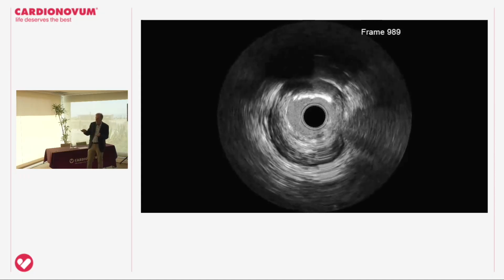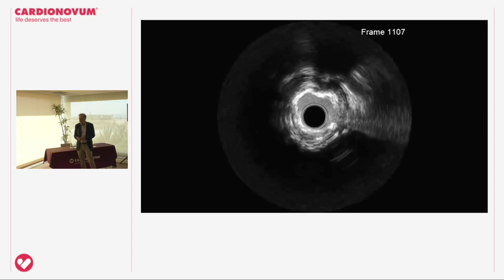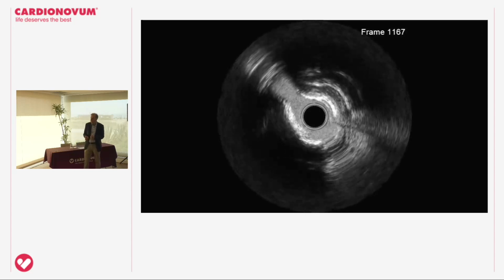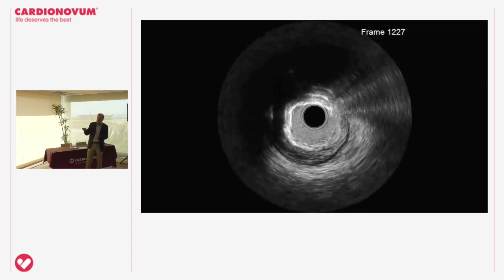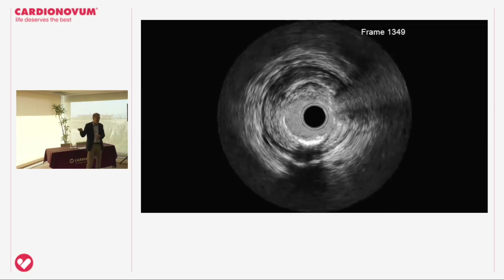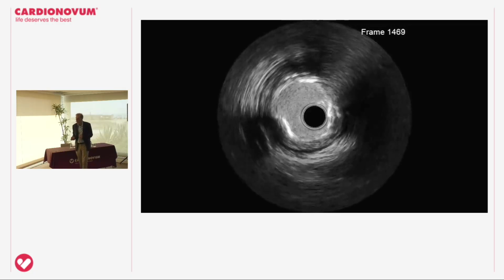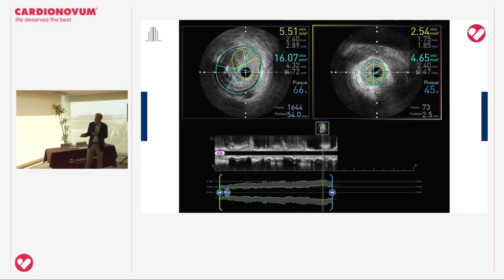So with this, clearly this is a long calcified vessel. And you know that when you plan to put a stent in such a vessel, probably the outcome wouldn't be that good. So we made some measurements, the discrepancy between proximal and distal references, etc. You have a very small vessel distal and a bigger proximal.